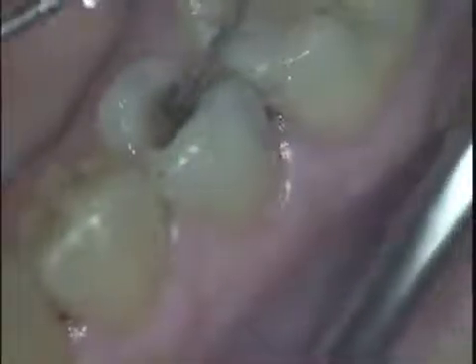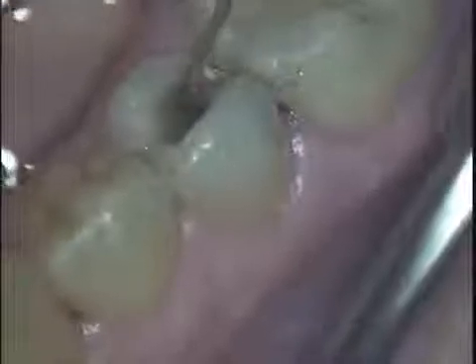Here, a Class 2 restoration is demonstrated. An existing amalgam with associated caries is removed, followed by examination using an explorer. Because of the short height of this tooth, a bi-tine ring is not placed. However, a sectional matrix with a wedge can be easily placed in this area.